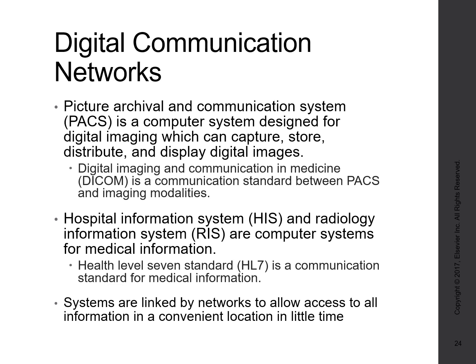The other thing in the RIS is often that radiology reports will be attached to the patient's information. It's also the RIS that we're working from. Once that patient is checked into the RIS, if you go to your imaging equipment, most of the time there will be a work list, and your patient will pop up there on the work list so you can select them and then apply your images to that patient.